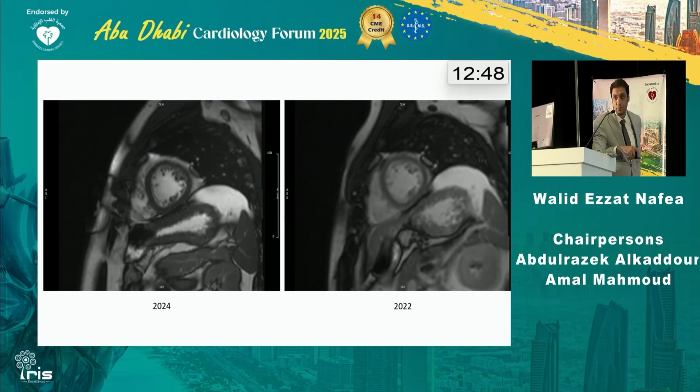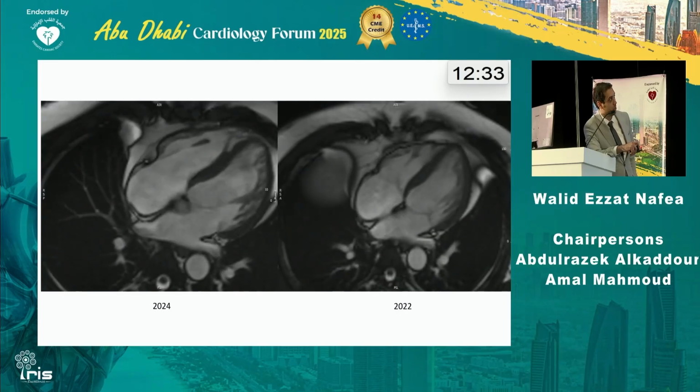So what about ejection fraction? Is it the same? Any input? So is it getting better or getting worse or static? Let's take another view. It seems worse.